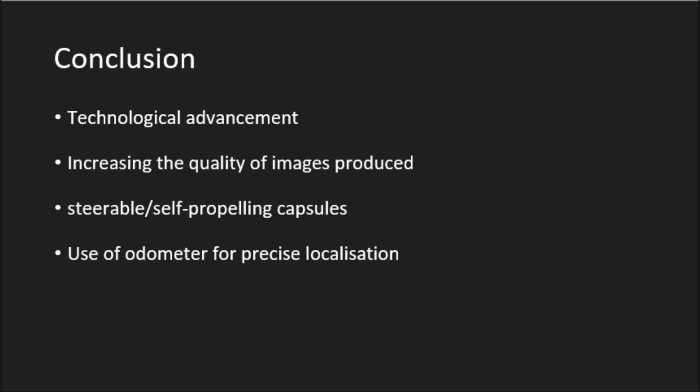The development of these capsule endoscopes epitomizes a leap in the evolution of medical technology, as it allows an active process of movement of the capsule through the gastrointestinal tract, where targeted areas can be specifically analyzed. Steerable or self-propelling capsules will also be beneficial in the future, as they will allow drug delivery and targeted biopsy procedures to be performed with ease.